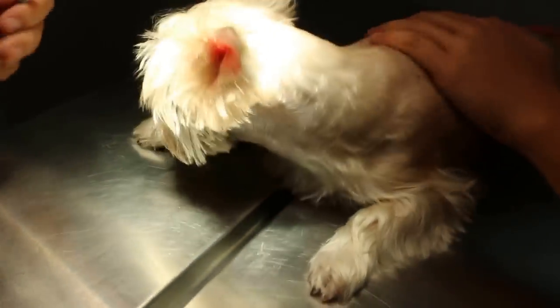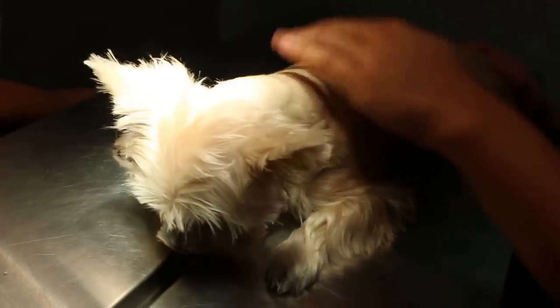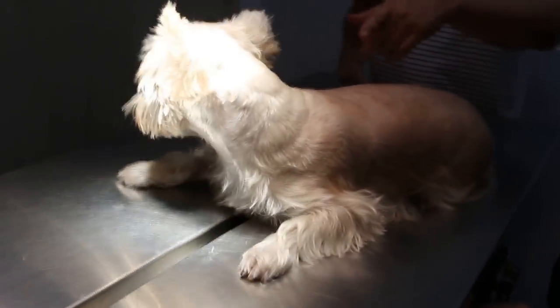So wait a while. What I do is irrigate the ears so you won't feel the pain. I'll set up first. You just focus on your videoing. So the dog should be down soon.